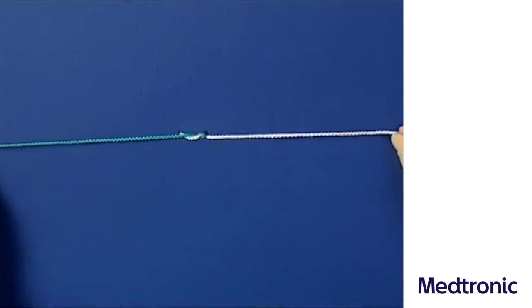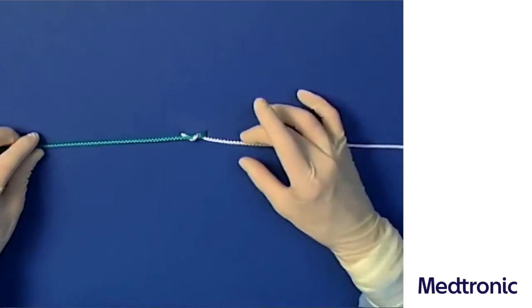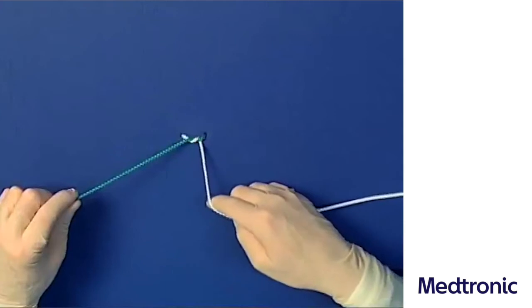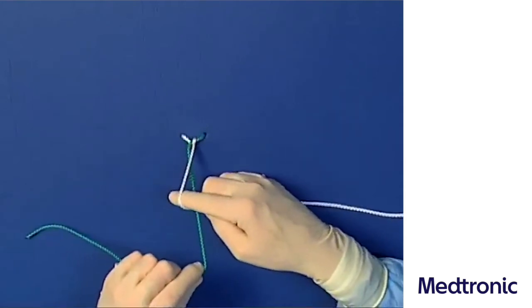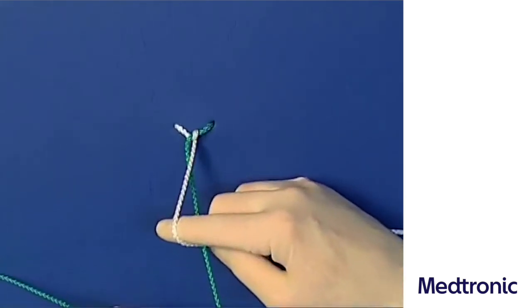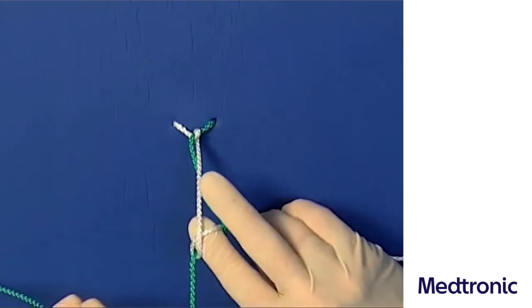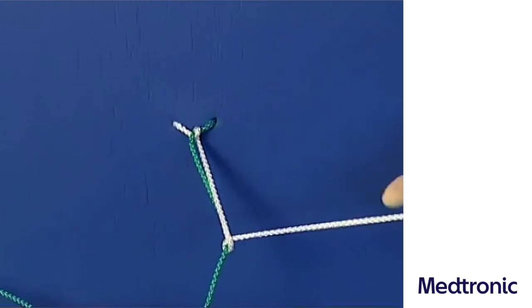For the sailor's knot, the second loop is described by use of the opposed technique. Here this is performed with the right hand using the so-called index finger technique. The left suture end, which is now on the right, is held between the thumb and index finger of the right hand and led radially over the last joint of the right index finger. The right suture part, which is now on the left, is led to the right so that it crosses the left suture end. The right index finger now moves below the left suture end, draws it upwards, and forms the second loop.